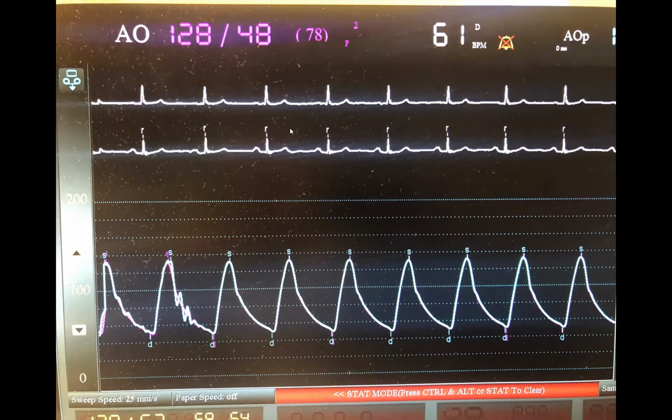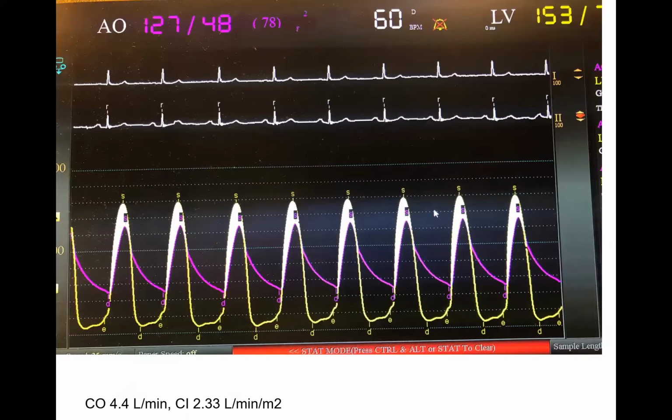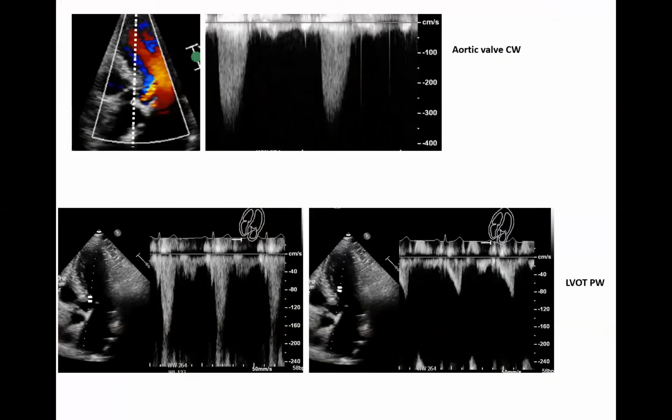Yeah, Dr. Hanna, this is Fani. So now that we don't have the Langston catheter, or it's on recall or something, is there another dual lumen catheter we can use? No, but you can do what I was just describing, which is a technique I like.